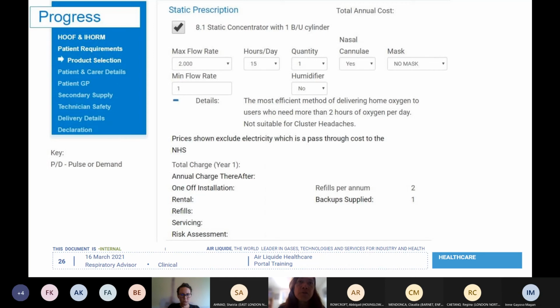And so forth and so forth. So the more information you gain about the environment in the house, the more it will help you understand the type of equipment and the risk imposed by having that kind of equipment in the house. So for a variable flow rate, you do need to enter the minimum flow rate so that we understand what the variables are.